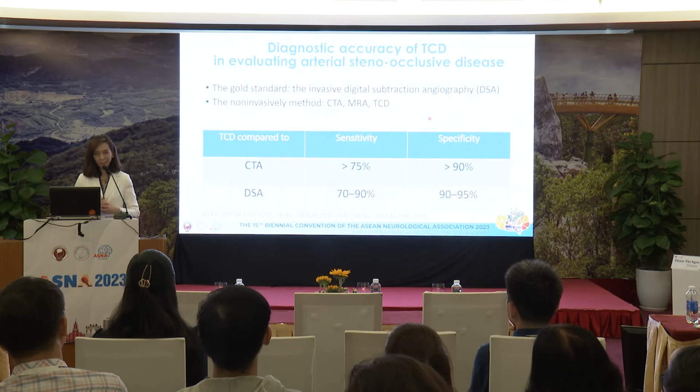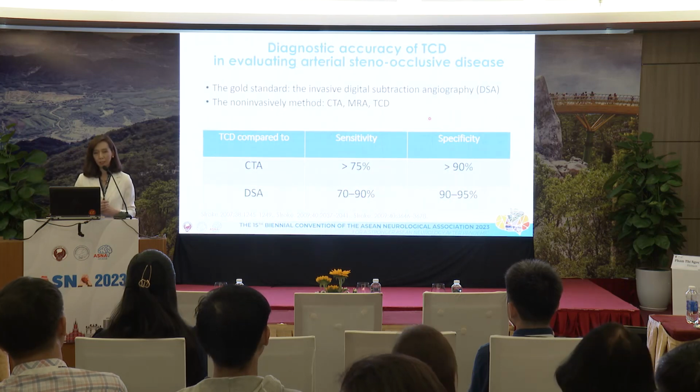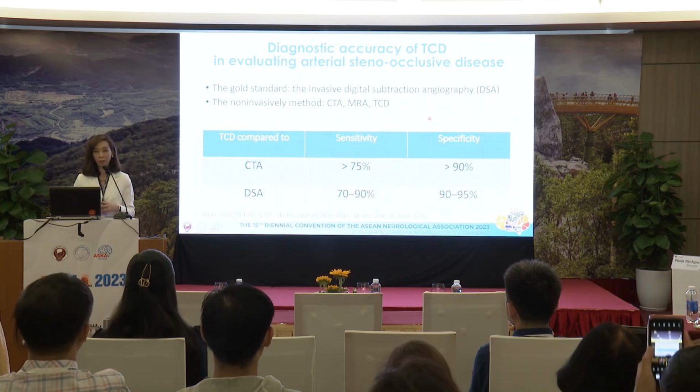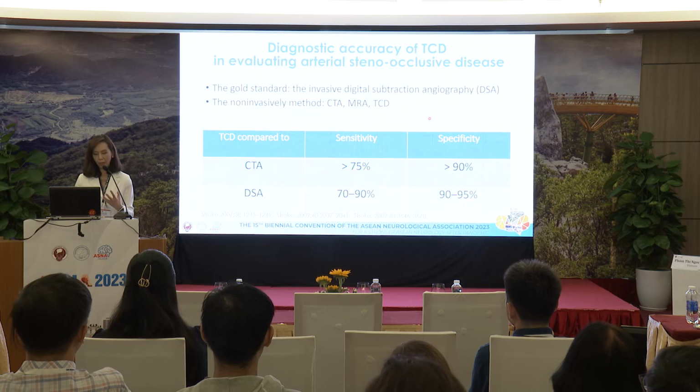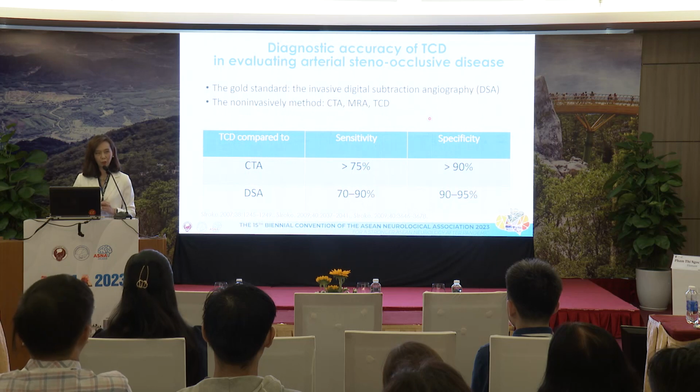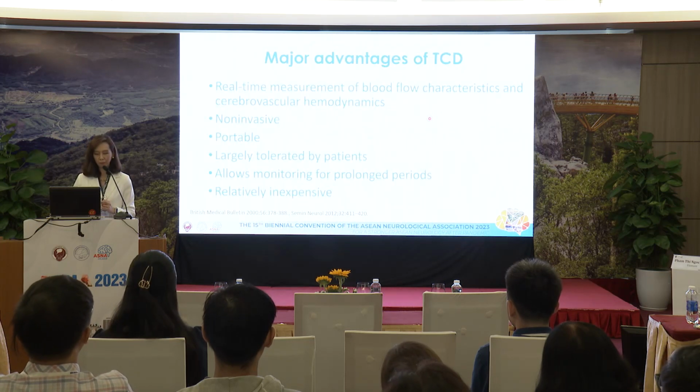And it has been tested in many studies that TCD is very good at picking up the stenosis of the blood vessel in the brain. So these are some of the examples of the sensitivity and specificity of TCD comparing to CTA and DSA. And it's actually, I would say, operator dependent quite a lot.